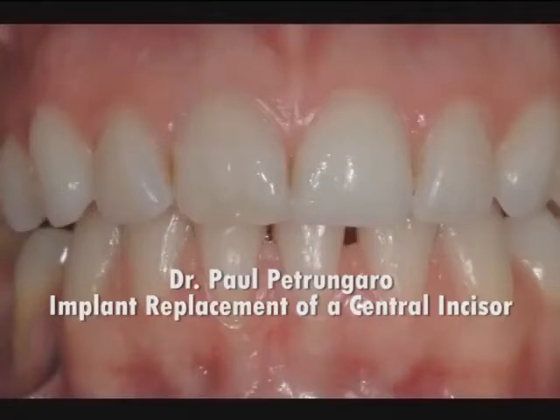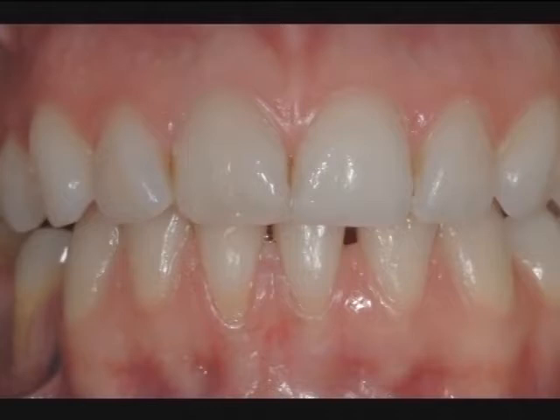The procedure we'll be discussing today and reviewing will be the replacement of tooth number 8, which is a failed endodontically treated tooth. It'll be atraumatic tooth removal, flapless implant placement, flapless bone grafting, and immediate provisionalization of tooth number 8. As you can see from the clinical photo, the requirements for aesthetics are extremely high, and we will be preserving all of the soft tissue architecture that we can.